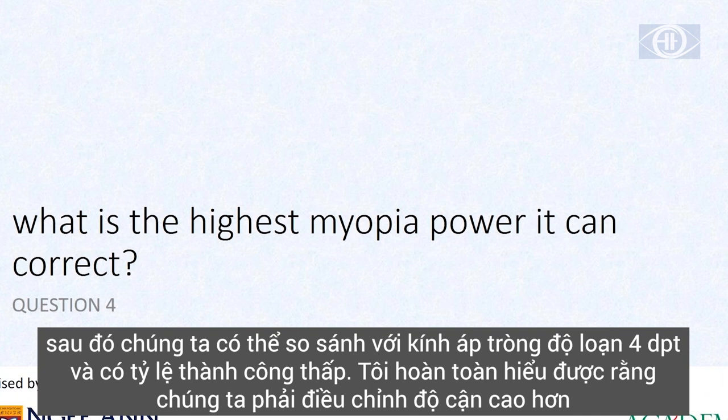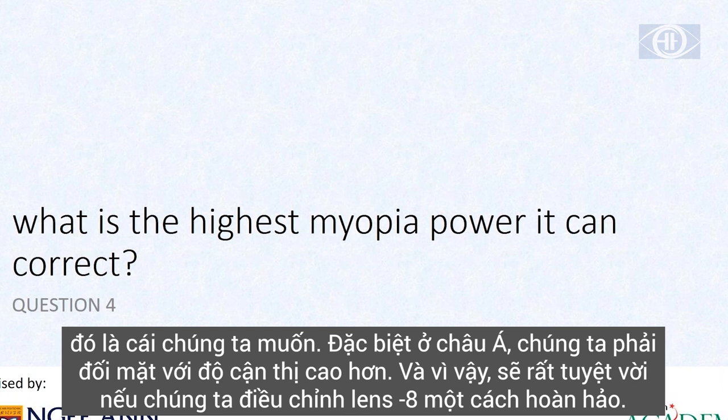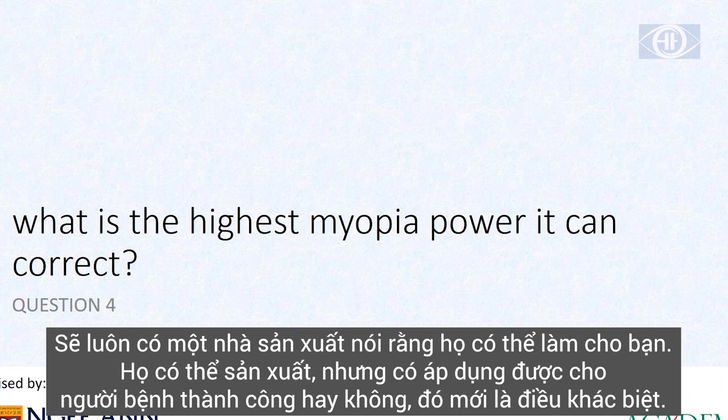And we have to encounter that with Ortho K as well. I completely understand that we all love to correct higher myopes. That's what we want. And it sounds rude, but especially in the Asian world, we have to deal with higher myopes. So it would be great if we have a lens to correct -8. Perfect. But there will always be a manufacturer who says, okay, we can do that for you. Yeah, you can manufacture it, but is the patient at the end successful? That's the big difference we have to understand.